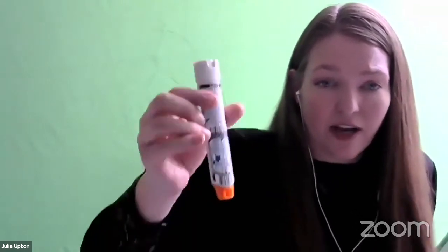But really, with a young child, the key pieces are to hold the leg and just try to get it in the right spot. Okay. And so Zara here said maybe you'd recommend 2 people that might be needed to help administer, one to hold the child and the other to do the administering. If 2 people are available, it would be helpful. Great. Yes. I'll just note that you won't see the needle. So this has a needle guard.